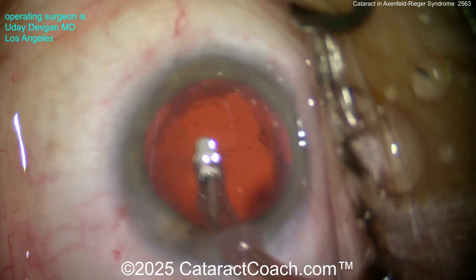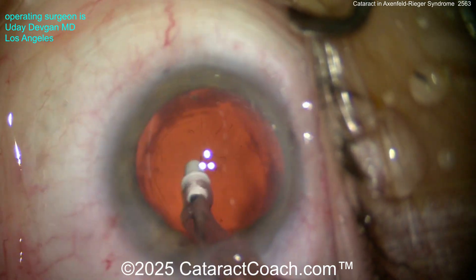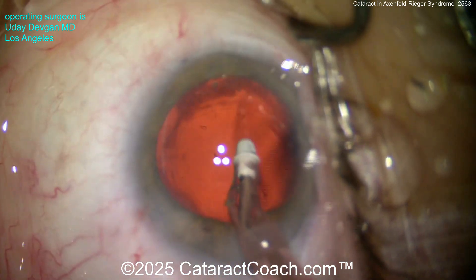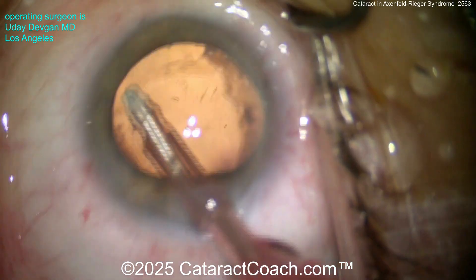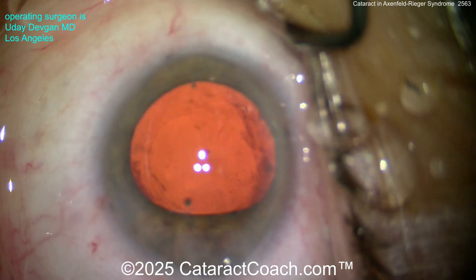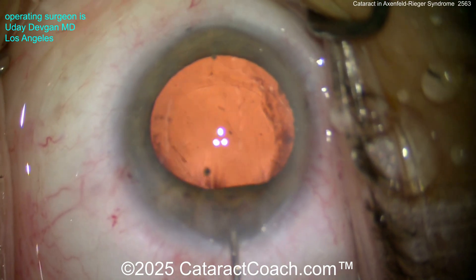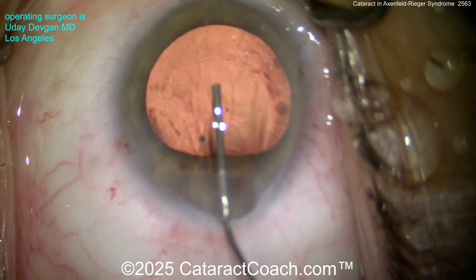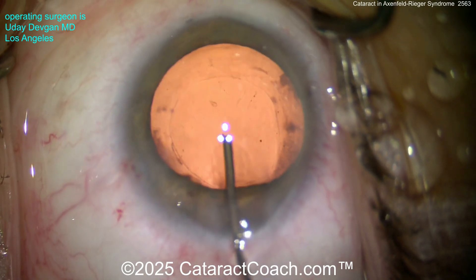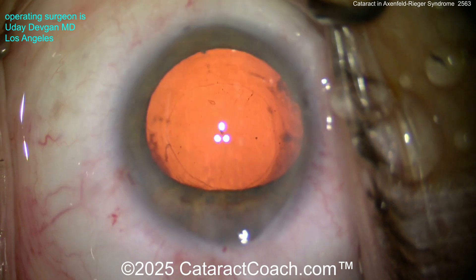Now cleaning up the posterior capsule — a little bit of polish there for that adherent lens material. This patient started off very myopic and wanted to remain myopic. Normally for near vision I recommend something around a minus two range — good vision at about half a meter or 50 centimeters. This patient wanted it closer, so we aimed for minus 3.5. That's the patient's prerogative — we double and triple confirmed with the patient, and the patient was thrilled with the outcome.